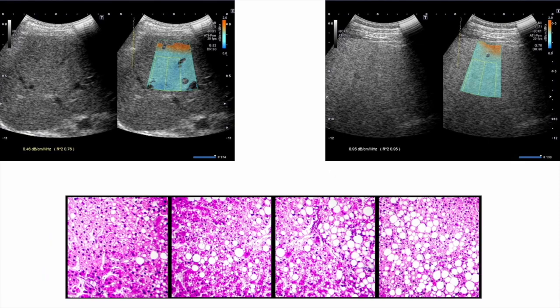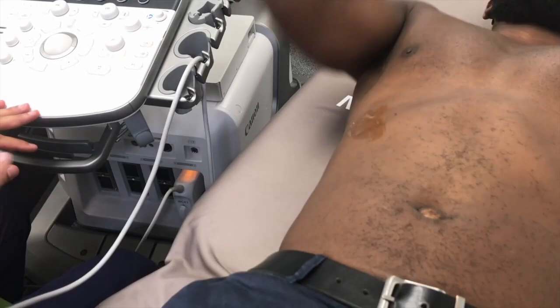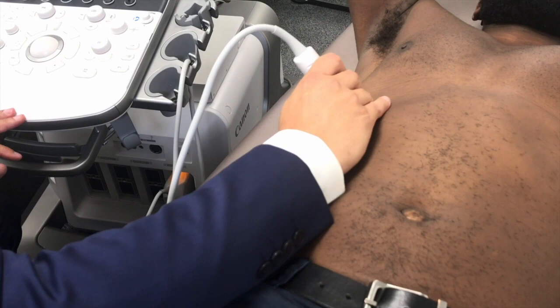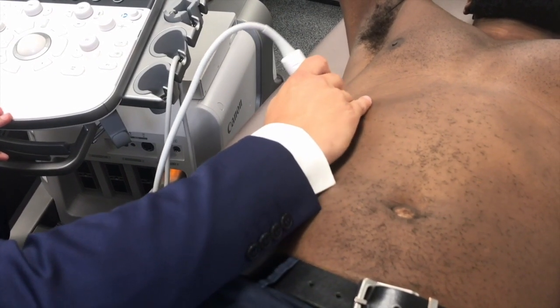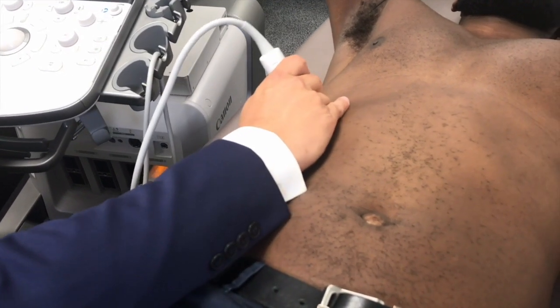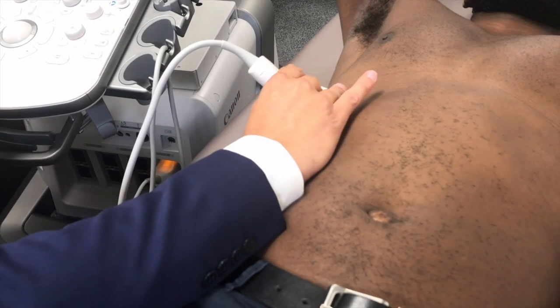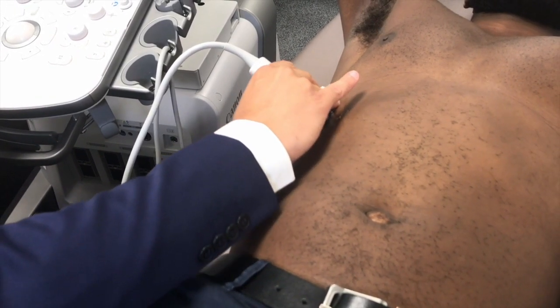You can perform this acquisition in the same patient position required for the shear wave exam. You can therefore carry out two examinations without repositioning the patient.